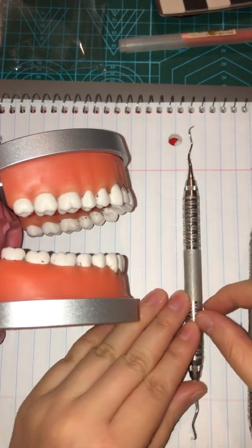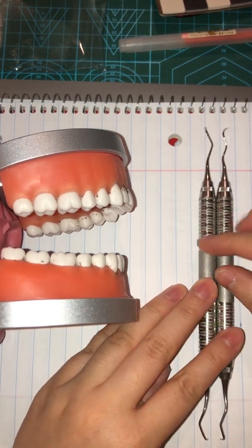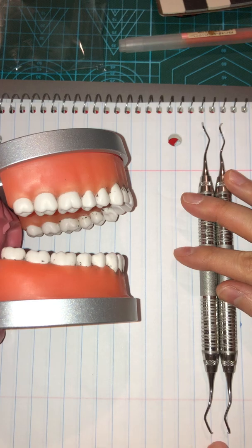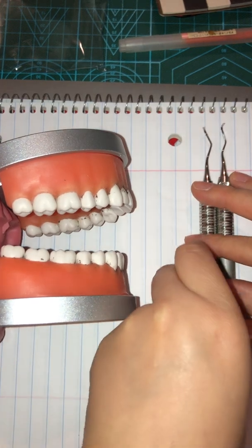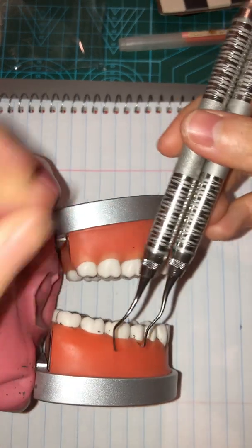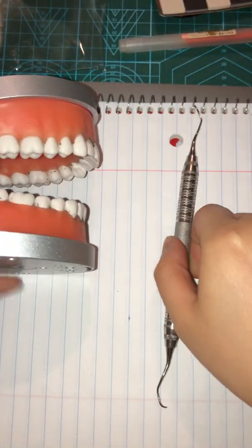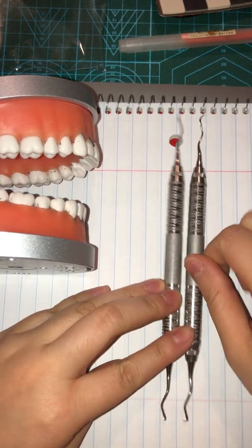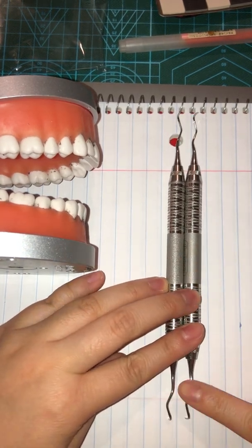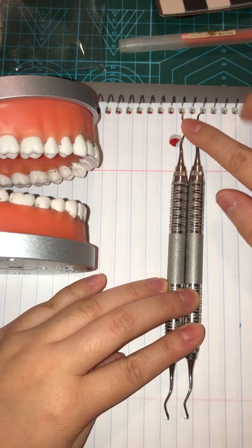And what you want to do is you want to find the side which is the V to the D, because when you position it to your typodont, it's V to the D, right? So for the competency, I would probably roll this side versus this side.